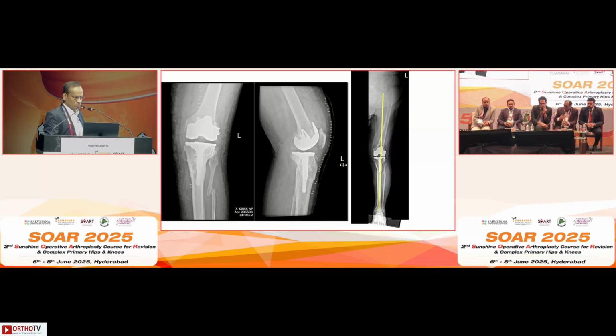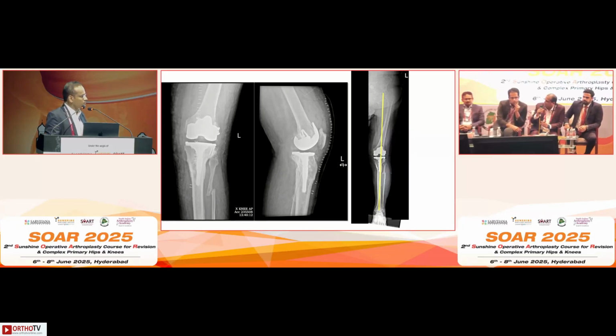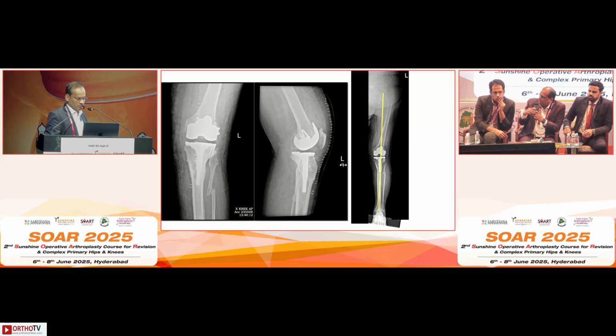That's what we discussed in the previous case, like proximalization of the osteotomy. Usually these osteotomies help to open the space rather than reducing the space. So these osteotomies, at least for our Indian scenario, should be reserved for opening the gaps, like what you did now, rather than the previous case. Yeah, because for completion's sake, I only pointed out 2 cases.